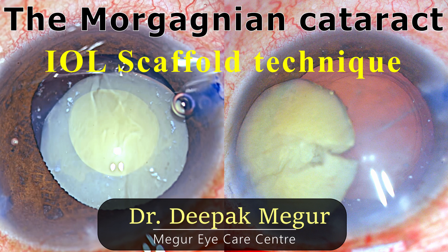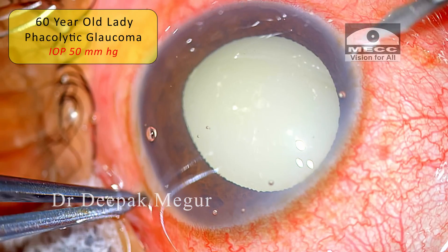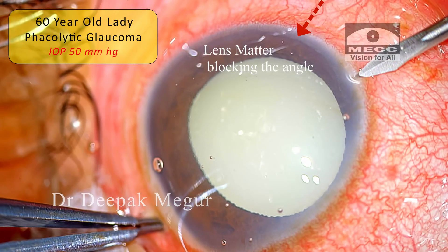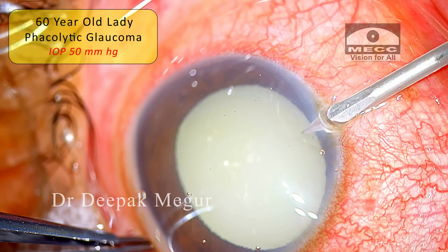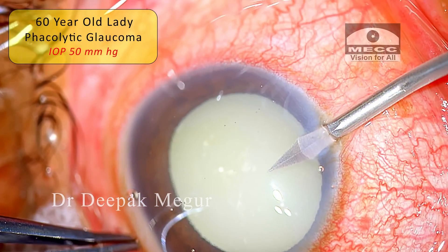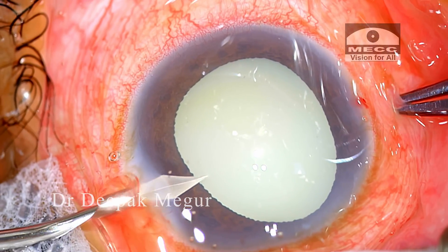This is a 60-year-old lady with phacolytic glaucoma. She has persistent raised intraocular pressure and severe inflammation for the last few days. She is treated with IOP-lowering medications and topical steroids for two days and then she is being posted for surgery.